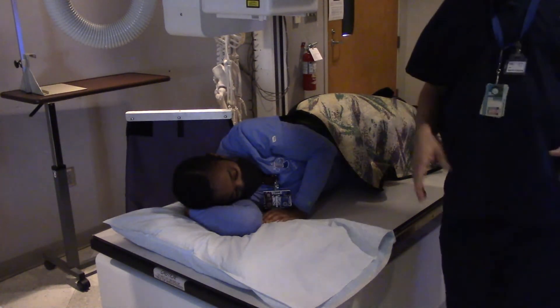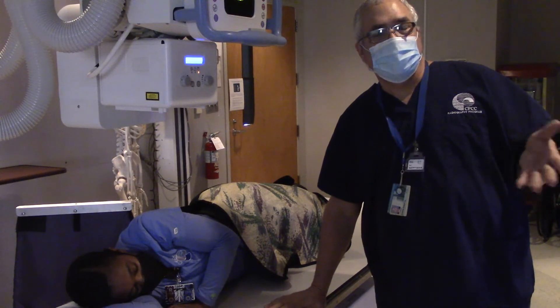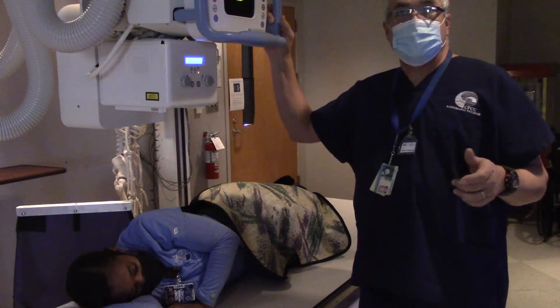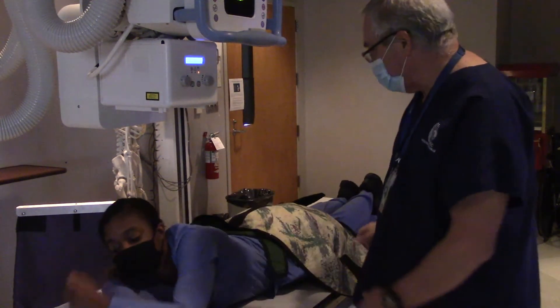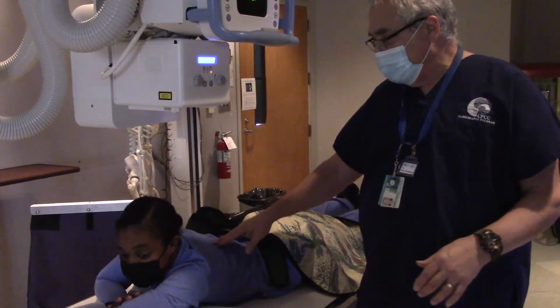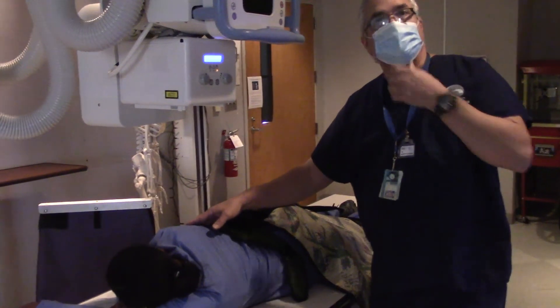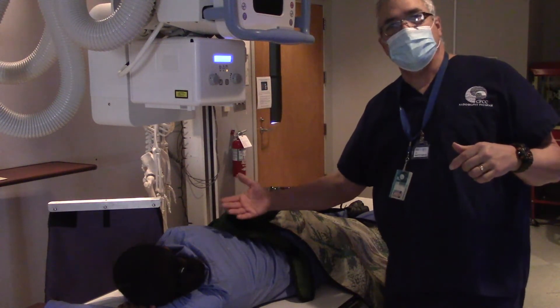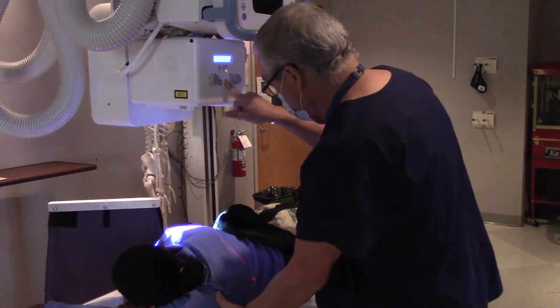All right, now for my next picture. This one is not as popular — a lot of doctors don't really care for this — but it's something we're going to teach you anyway, just so you have it in your bag of tricks. This is going to be an LAO drinking — left anterior oblique. All right ma'am, if you would, roll back over on your stomach again like you were before. Okay, she's already rolled up into a shallow obliquity. 45 degrees for this is probably too much, so if you look at your patient and you think they're 45 degrees, roll them back down just a little bit.